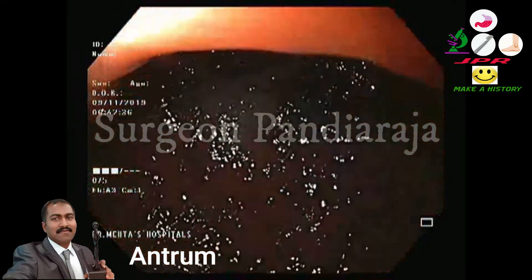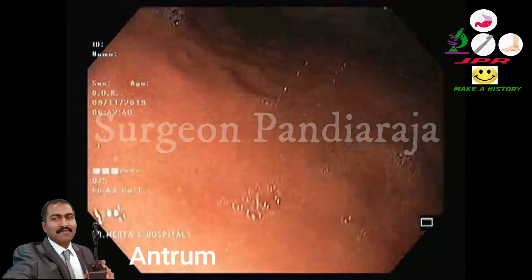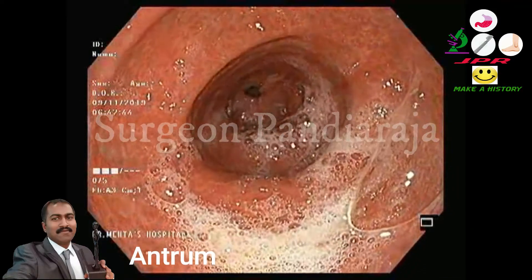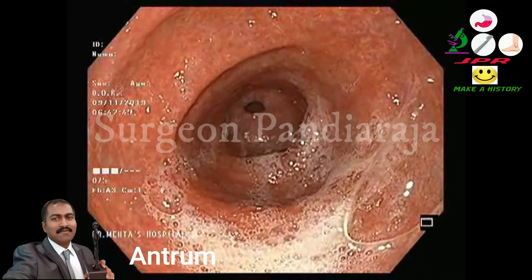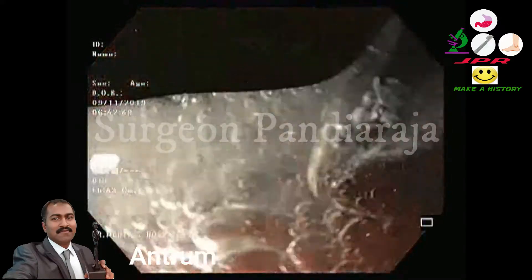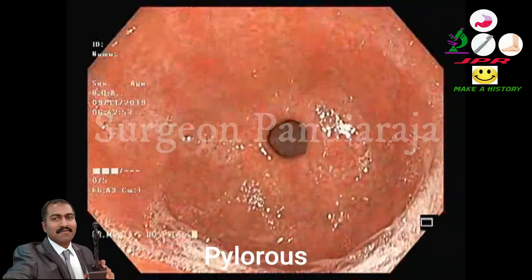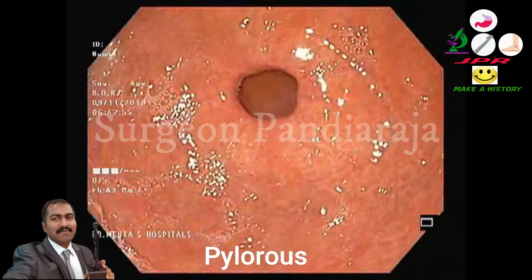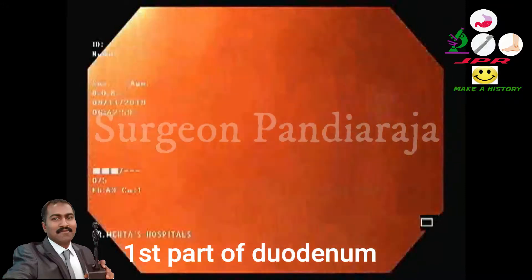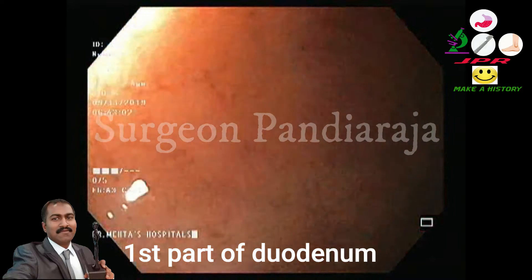After that, we will enter inside the antrum. After examination of the antrum, the scope is advanced inside the pylorus. After successful intubation of the pylorus, we can now see the mucosal pattern of the first part of the duodenum.